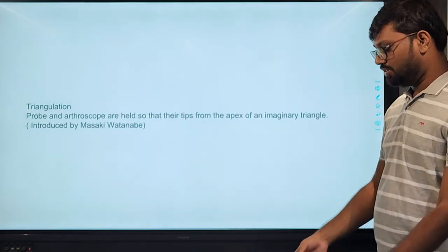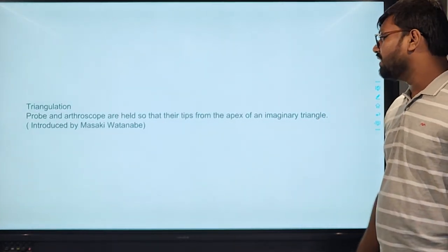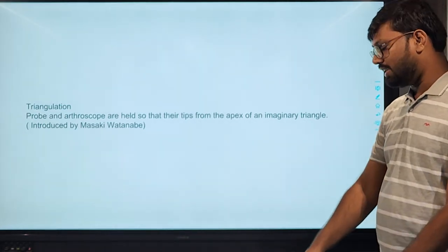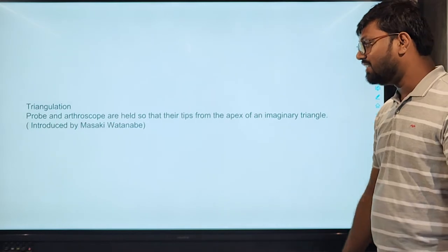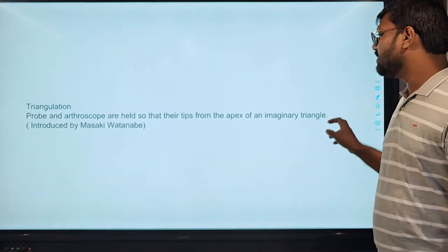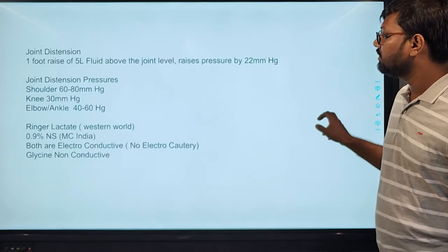Triangulation of the arthroscope and the instrumentation we are using. The probe and arthroscope are held in the hand so that they form an imaginary triangle, and this is called triangulation.